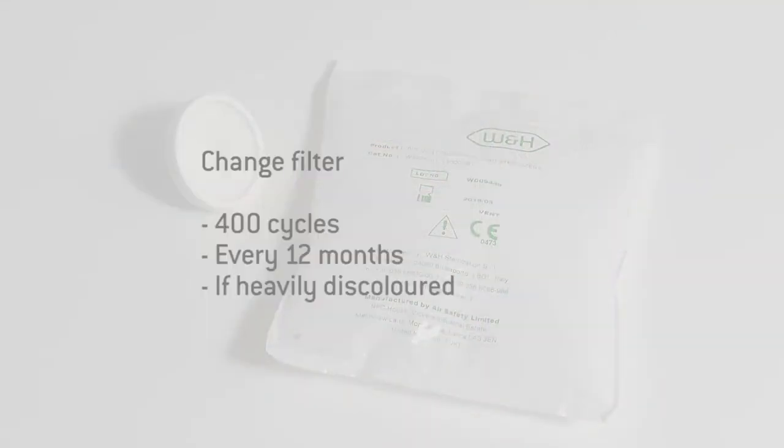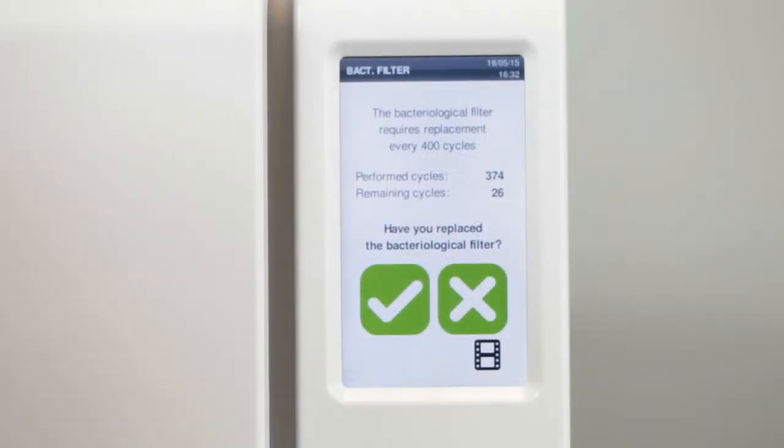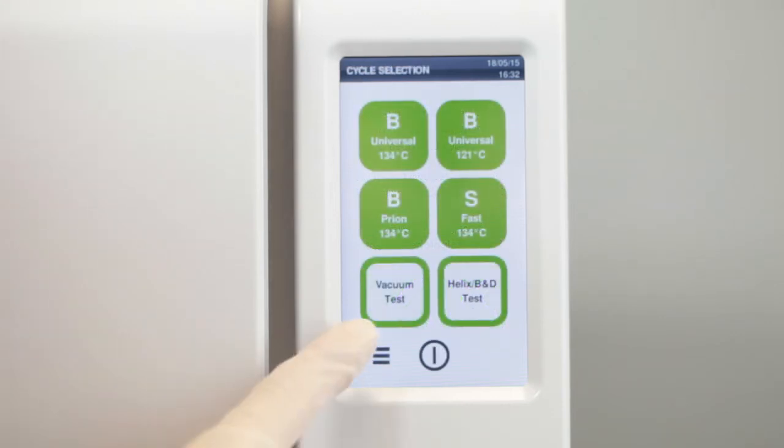If the bacteriological filter is heavily discolored due to dust or has not been changed in the last 12 months, it must be replaced immediately. Your Lisa sterilizer notifies you automatically when your bacteriological filter has reached its expiry date and needs to be replaced.